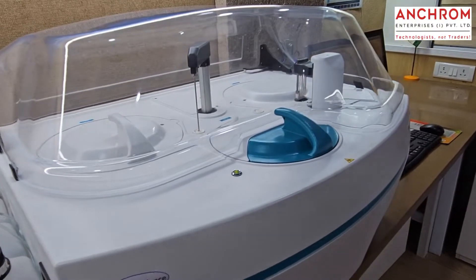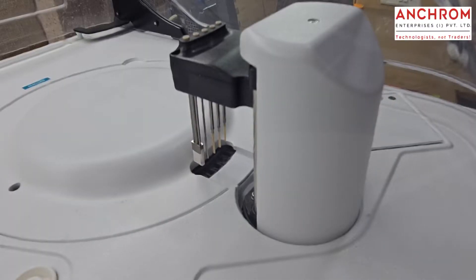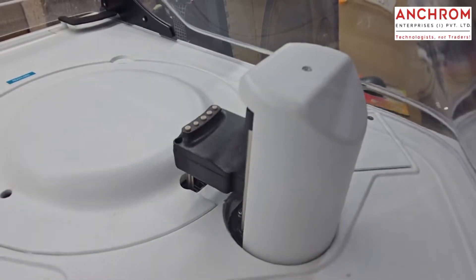Once the analysis is done using the colorimeter that is built into the instrument, the cuvettes are automatically washed and ready for reuse. So there is no wastage of plastic and no environmental problem associated with it.